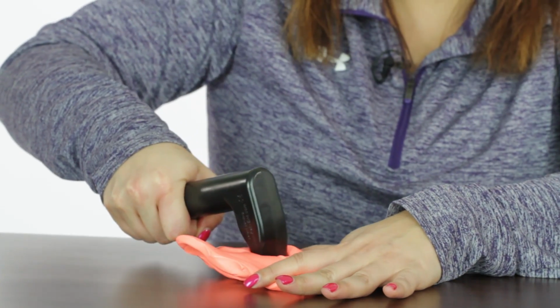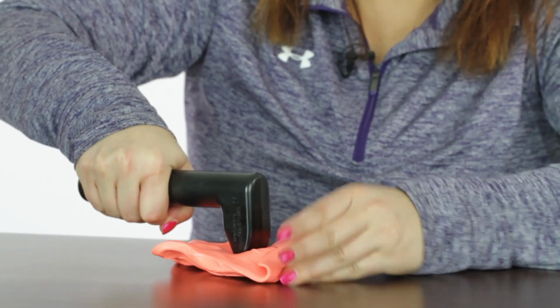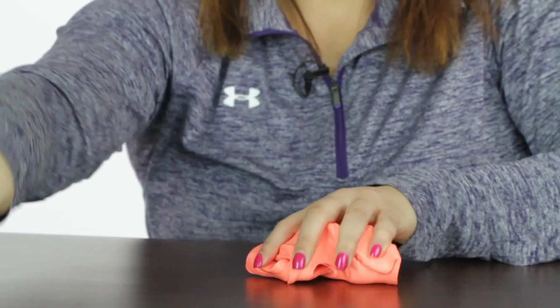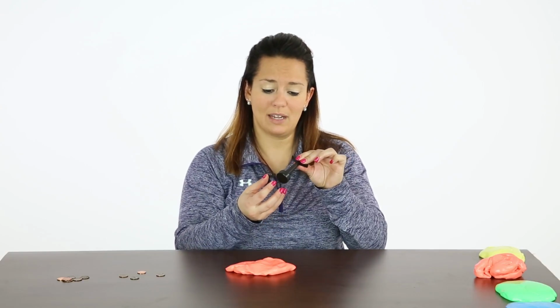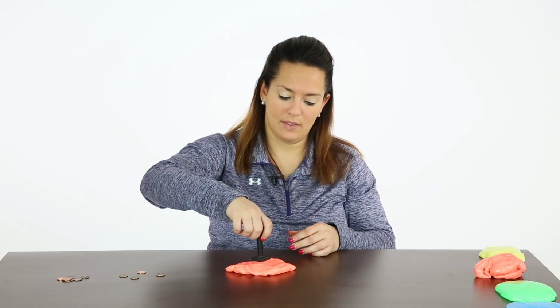So again, raking for more whole arm shoulder strength, and then kind of more of a lever to go up and down for turning and twisting. The next one is the Putty Size Cap Turner. So this simulates a medium cap, maybe for a soda bottle or something like that.